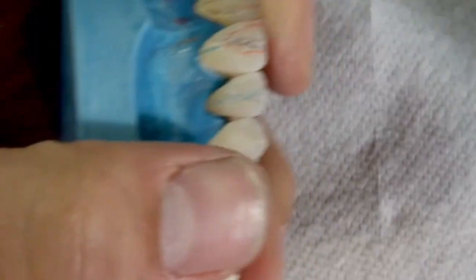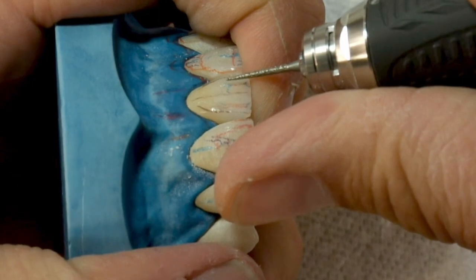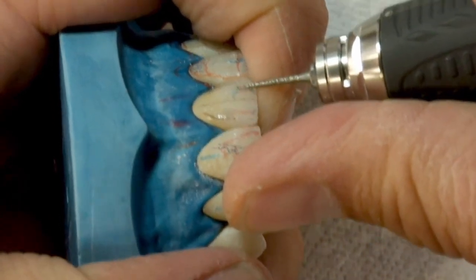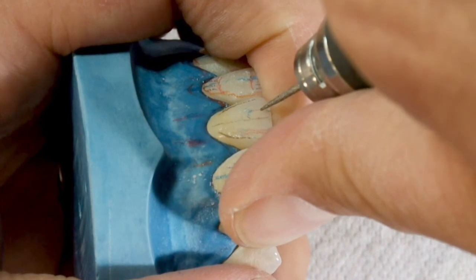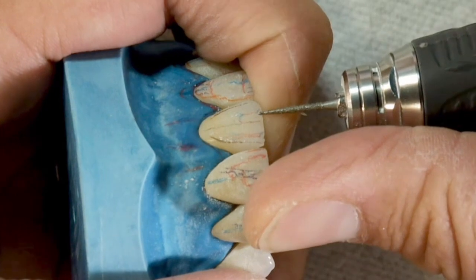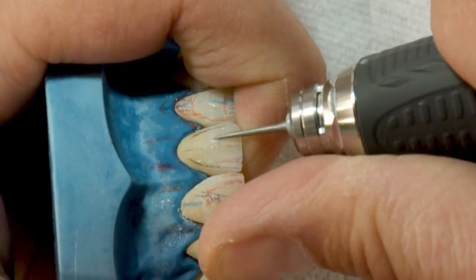When the burr is flatter on the surface, we will be making wider depressions. Straightening the axis of the burr, the tip will dig deeper. We change the angle accordingly to the zone and features of the depression. In reflected light, the relief of these vertical depressions is highlighted and they really look just like those of natural teeth.